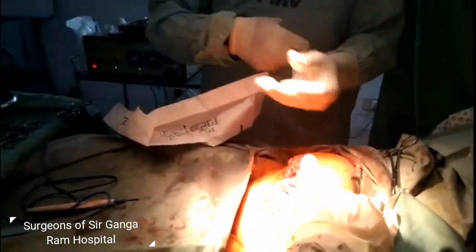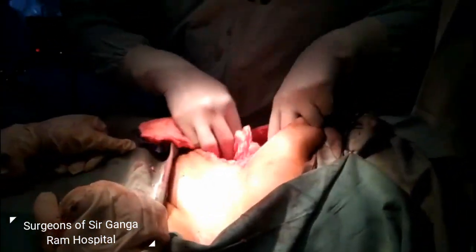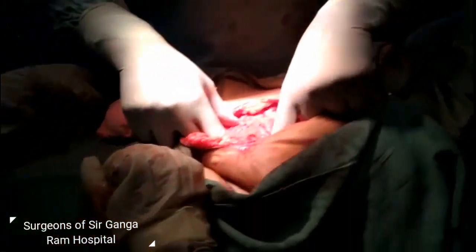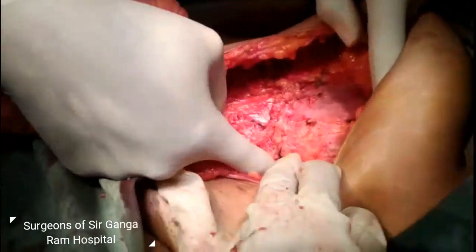In this video, we will perform primary tissue repair. After that, to maintain sterilization, we will change our gloves. After the primary tissue repair, the sac is repaired and we will wash with normal saline. The defect is approximately 5 cm, and we will do dissection all around this defect.